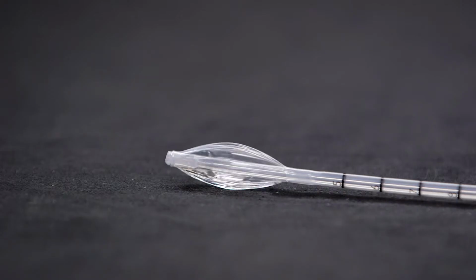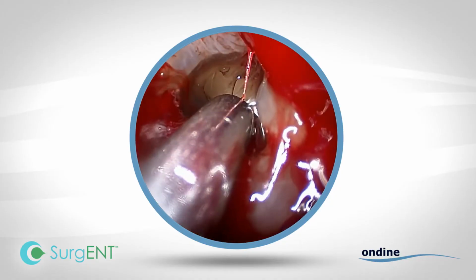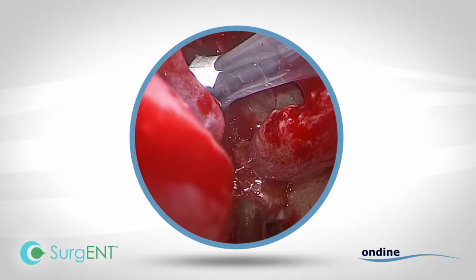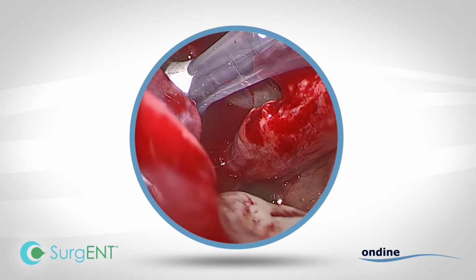The device has a very soft, pliable type balloon on the end of it. So you inflate the balloon into the sinus and it conforms to the shape of the sinus. Filling the sinus, it puts some pressure up against the side walls of the sinus, and then you irrigate around the outside of that balloon, between the sinus wall and the wall of the balloon. And that forces that liquid to kind of dispel at a very high pressure around the balloon and forcing the debris that's built up in the sinus to come out.